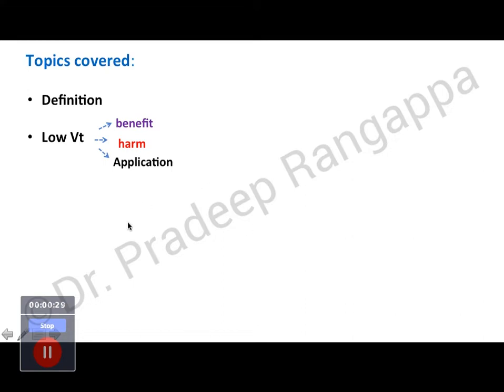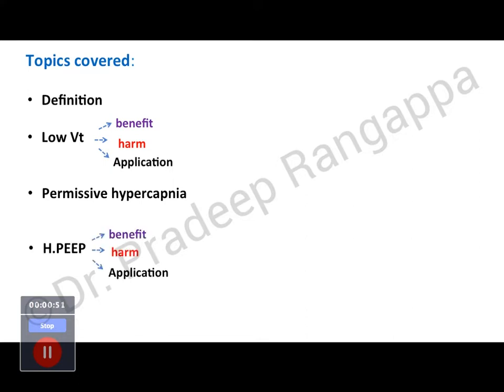And when you talk about low tidal volume, you need to understand what the benefit is, what the harms are, and how we apply this low tidal volume. Then the second one we need to understand, the offshoot of low tidal volume, is that you can have permissive hypercapnia. Although hypercapnia sounds dangerous, it can be beneficial, and how much we can allow is something that we all need to comprehend. So the first pillar is low tidal volume.